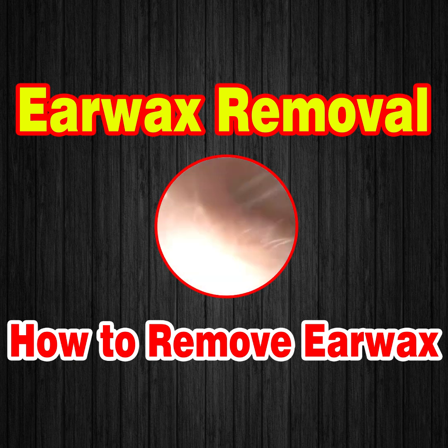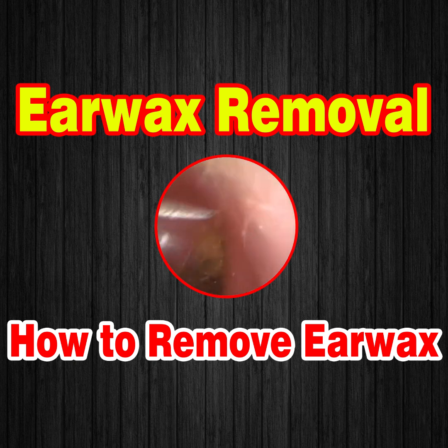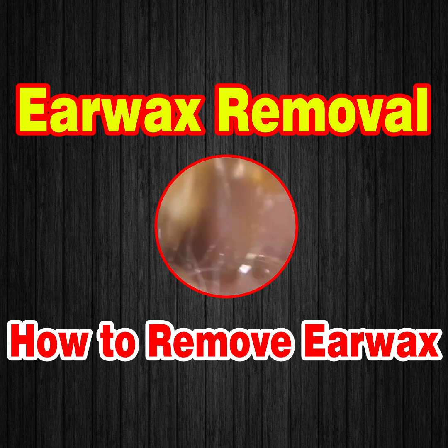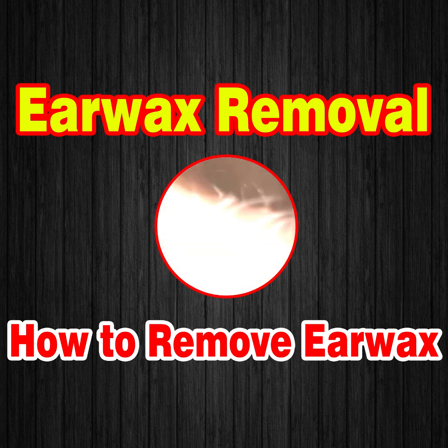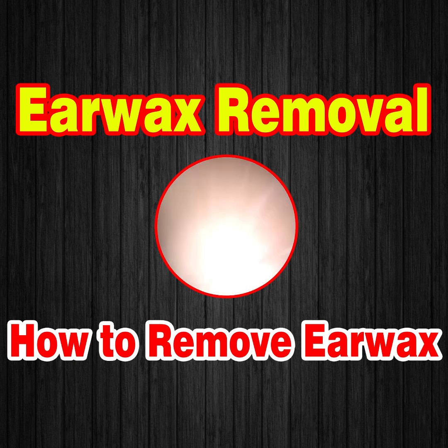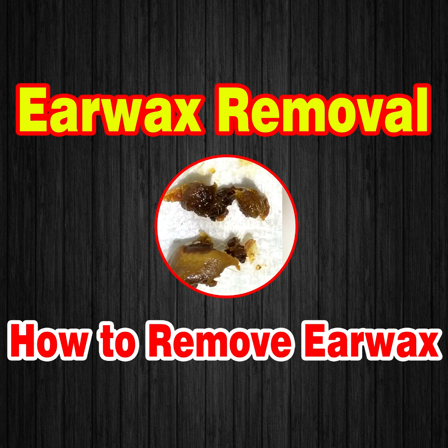Those are those hairs at the entrance. You can see the lens a bit. There's also a few matted hairs here. It can sometimes suggest the wax has been pushed in, but also they can become loose and confined to these sometimes. So again, you can see how bendy that ear is, just straightening it out. You can see the whole ear from there. And that's the debris from both sides.